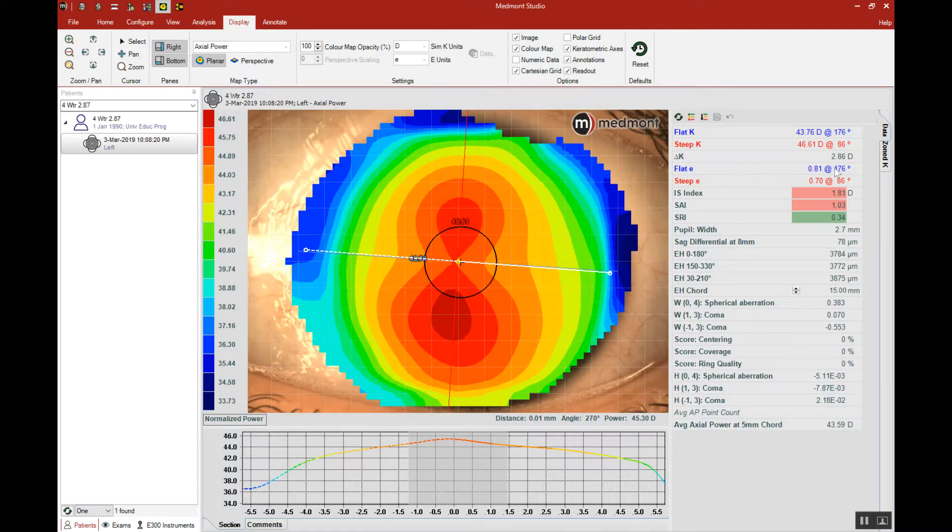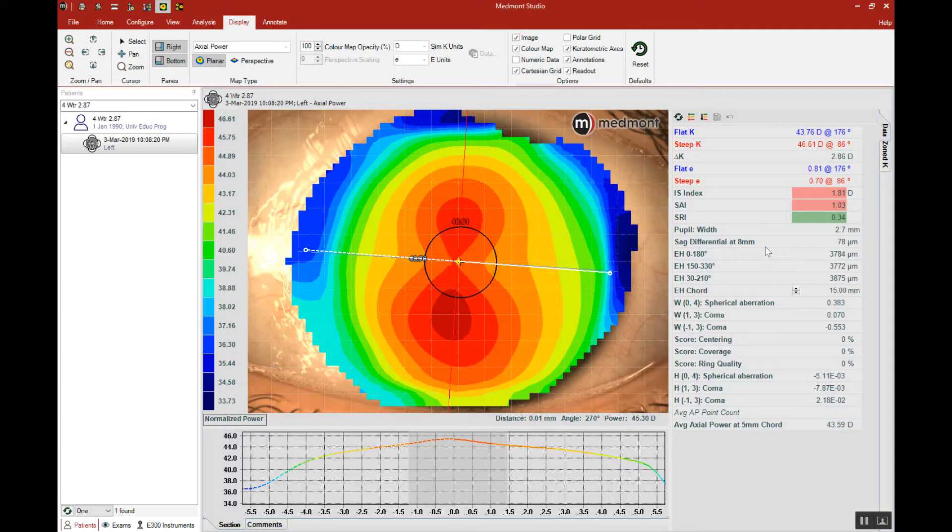However, you can also see that the corneal astigmatism is relatively high. We have 2.86 diopters of corneal astigmatism, indicating we have a fairly astigmatic patient. We could also look down here at the sagittal differential that looks at the peripheral corneal toricity. This eye has almost 80 microns of sagittal differential.